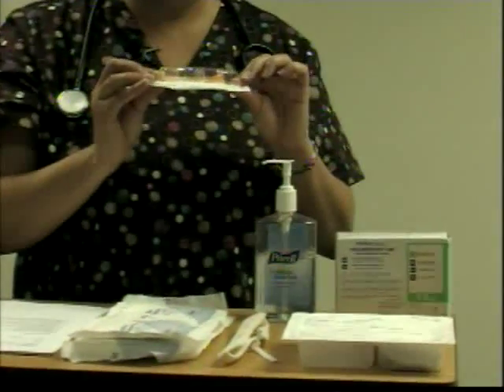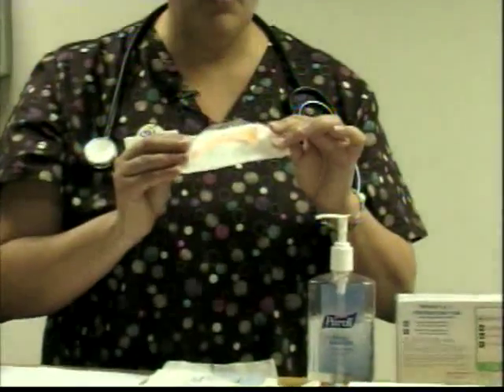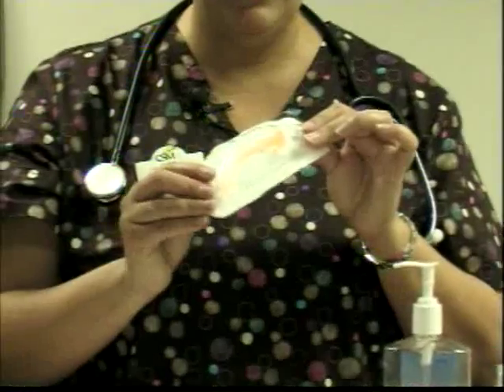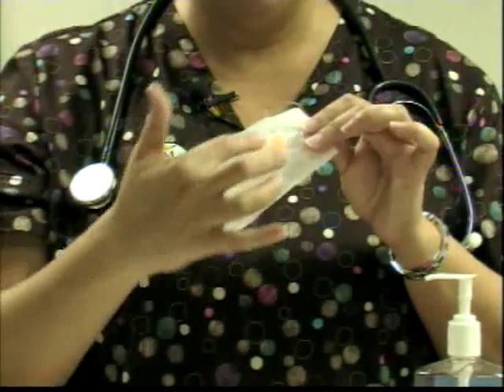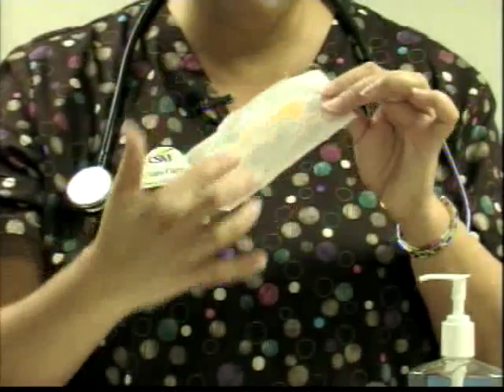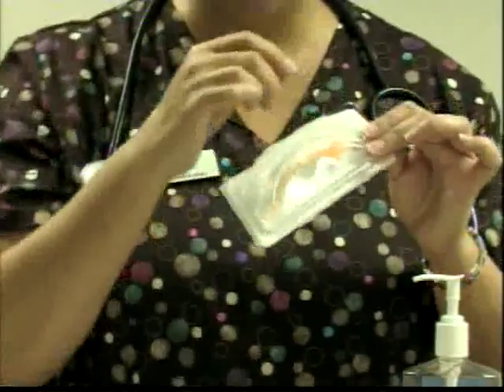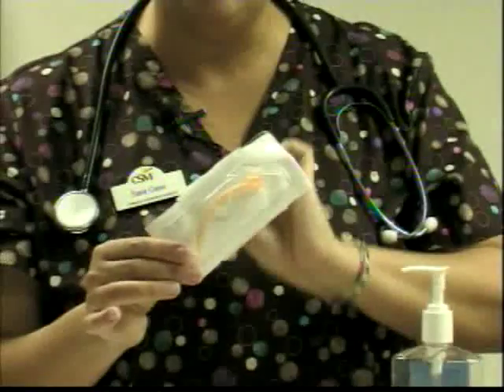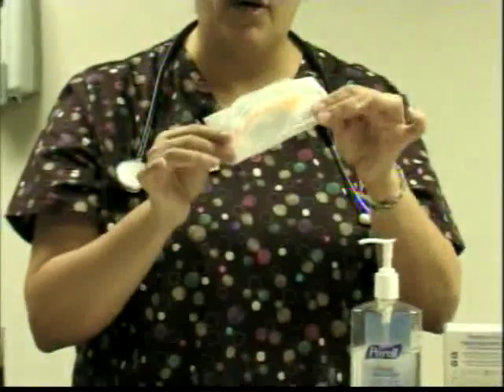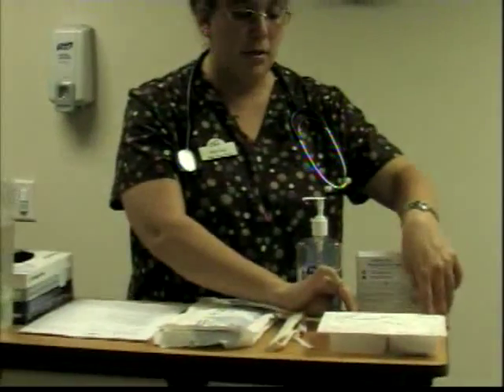And let me say a thing about inner cannulas. This is something that you will see more and more in the hospital when clients are placed on a tracheostomy. They're using disposable inner cannulas. This is what you're going to change on the client. You're not going to clean the inner cannula and then replace the same one. The one that you're taking out, you dispose of in a red bag and you replace it with a clean one. Therefore, the patient should have at the bedside a box full of inner cannulas of the right size.